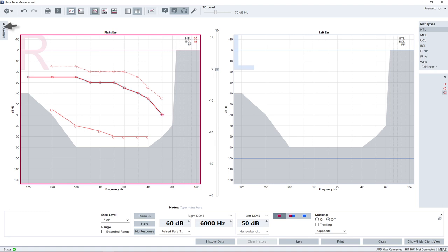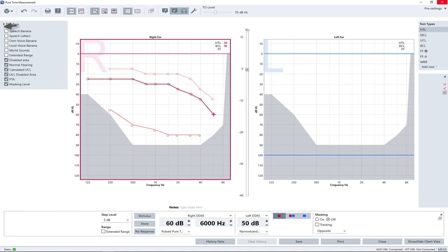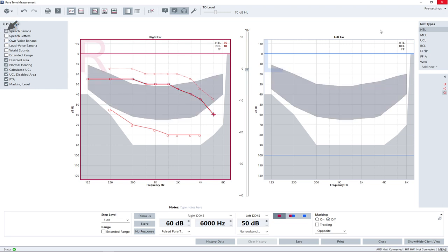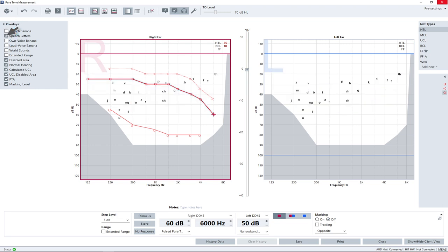The side panel allows you to overlay the audiograms with more information. For example, speech banana or letters for speech sounds.